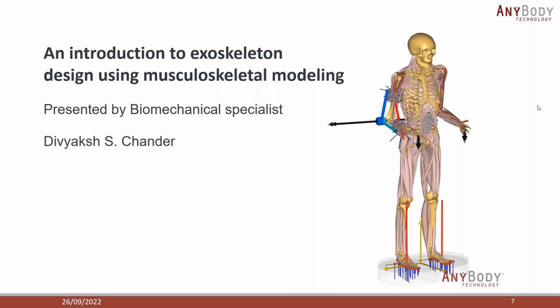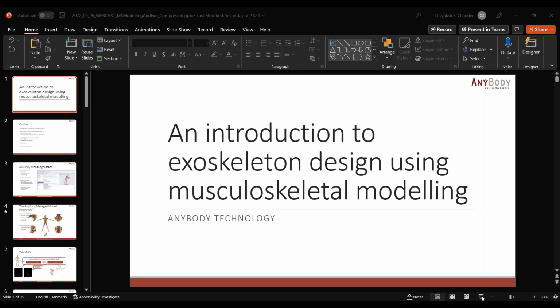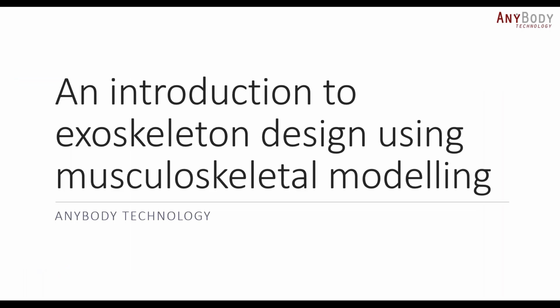Thank you, Christopher, for the introduction, and hello everyone. I am Divyaksh Chander, and I'll be talking about exoskeleton design using musculoskeletal modeling, but at an introductory level.